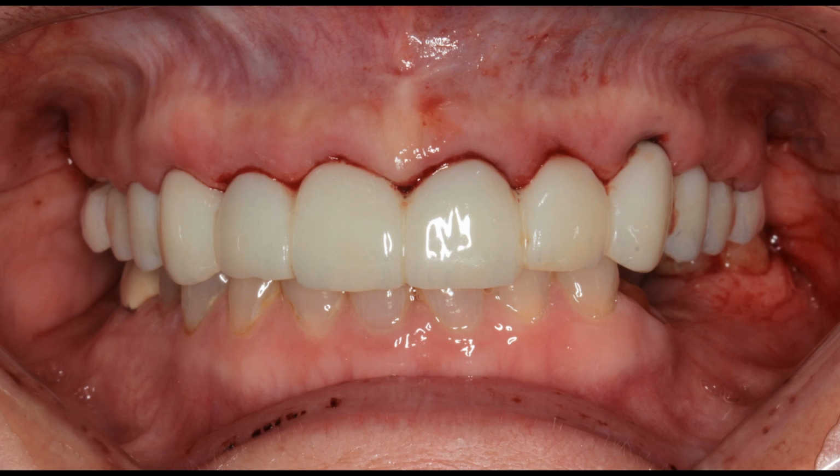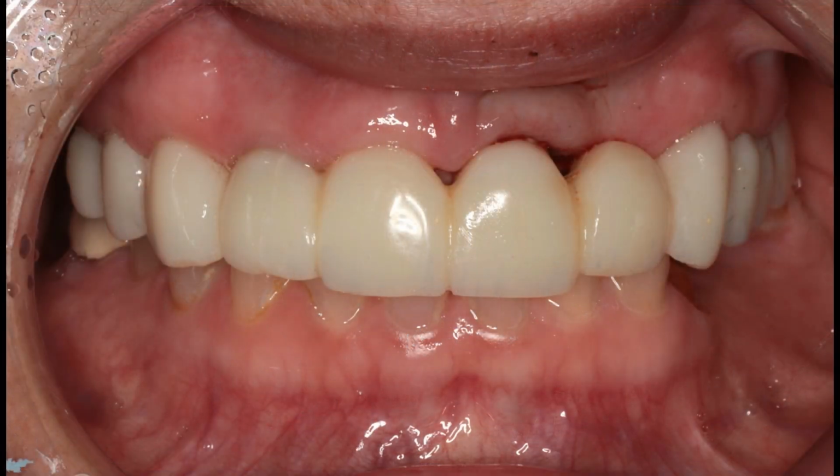So she returns in 6 months, and we placed more implants. But on this particular day, her left lateral incisor, her number 10 implant, failed. So because we didn't remove any bone, we were able to just move over to site number 9, the left central incisor, and place an implant there and make a new temporary for her that day. And I mentioned biotype in the last patient. Her biotype is incredible, and you'll be surprised how well her bone recovered. Her bone and gum tissues recovered even after a failed implant.